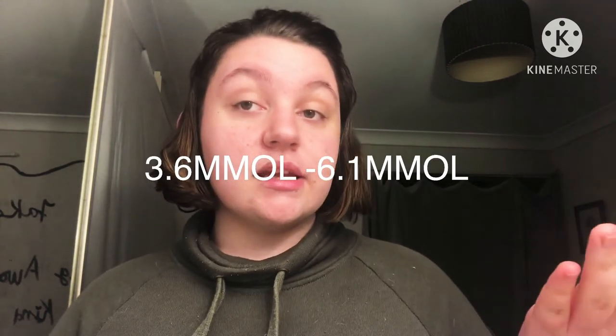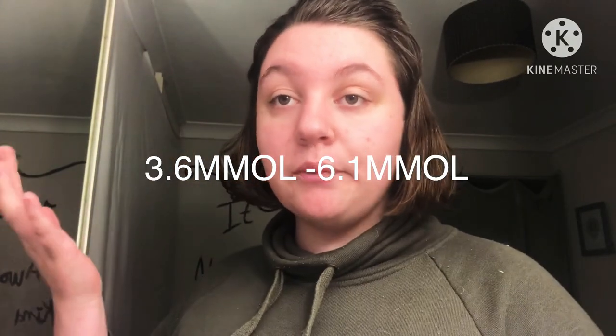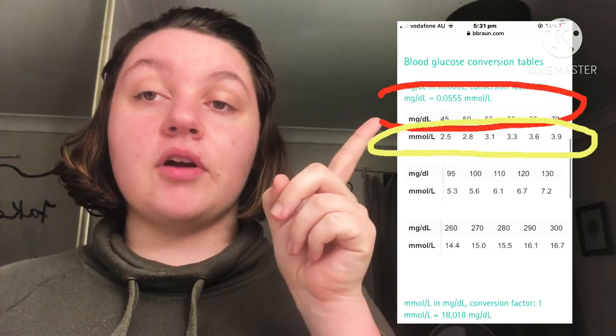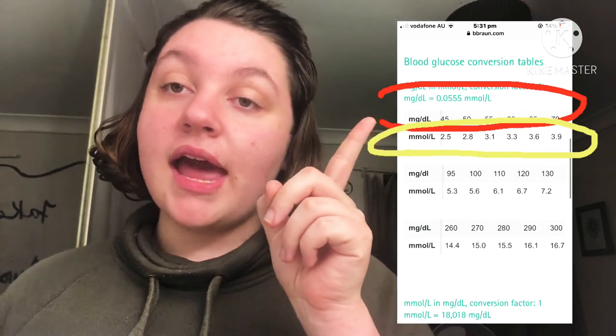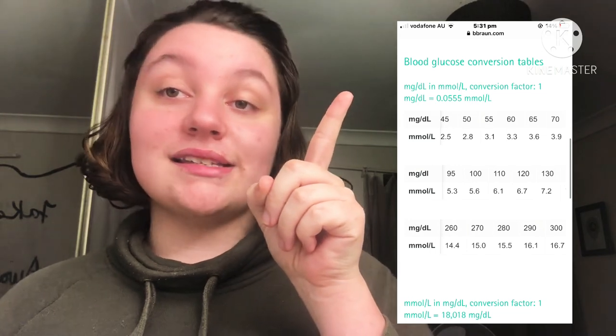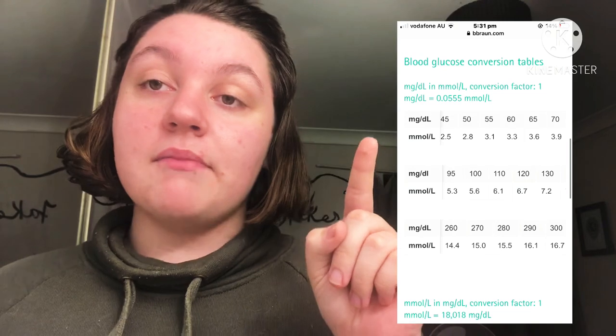For MMOL, anything from 3.6 to 6.1 is the good range, and anything below 3.6 is considered the danger zone. I'm going to pop up a chart here — the top row is MG and the bottom row is MMOL. You're looking for 65 MG as the lowest range before it's considered danger, and the MMOL equivalent is 3.6. That is your conversion and your range.